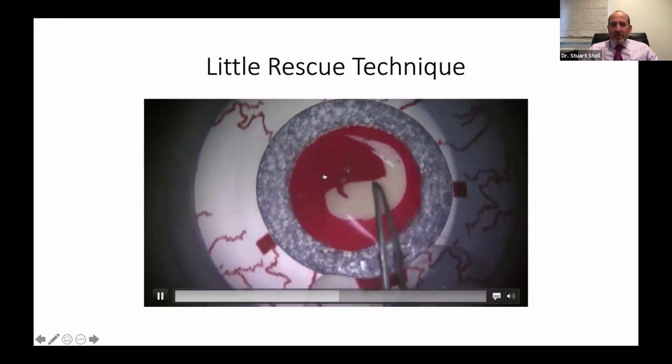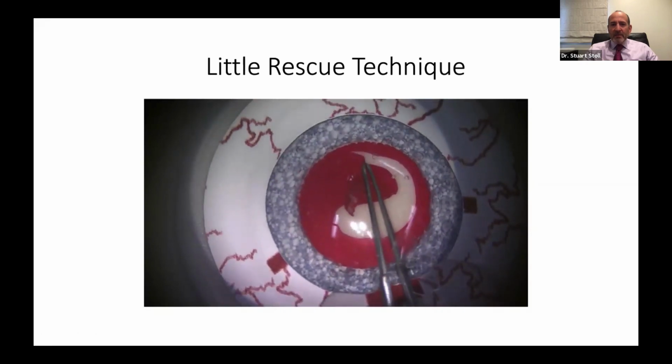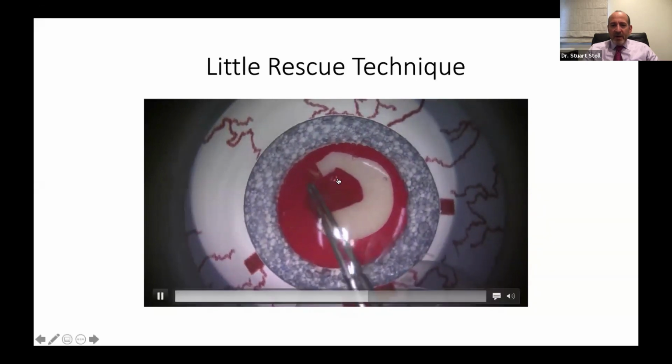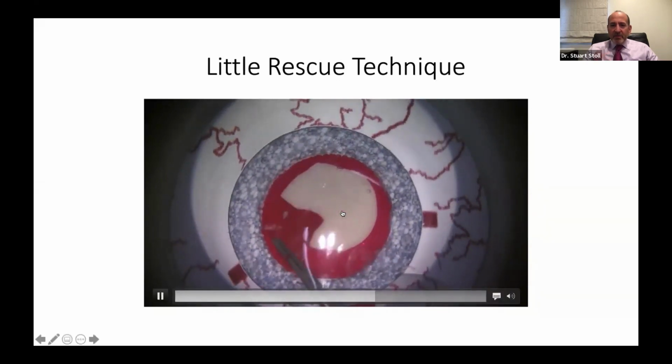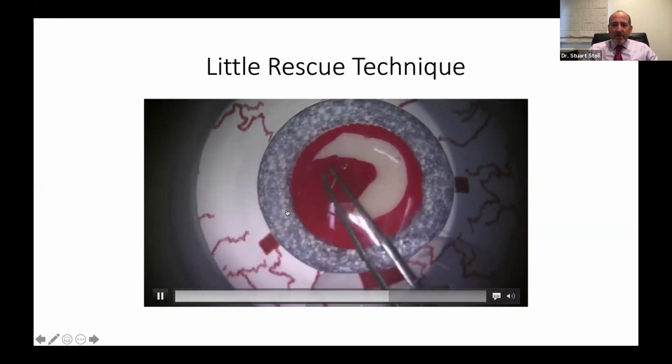So we're gonna go in here and grab. Now you'll see it tear a little bit, but no big deal. We can just grab again, and it's that radial maneuver after your circumferential that creates it, and then flip back over. Here's another rescue coming up.